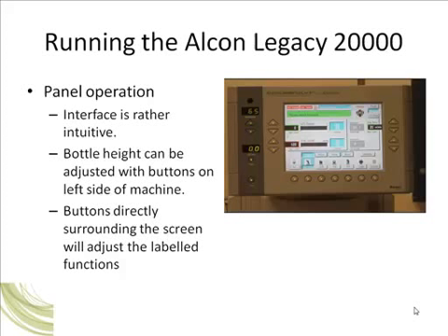Hopefully these things will make the fluidics more real to you or more intuitive and allow you to transition in surgery more easily. Running the Alcon Legacy 20000 is somewhat intuitive.